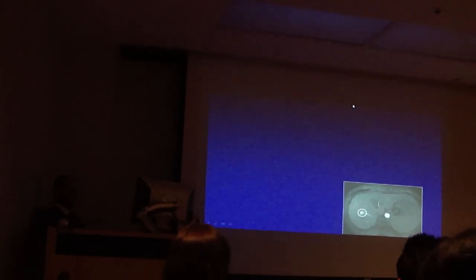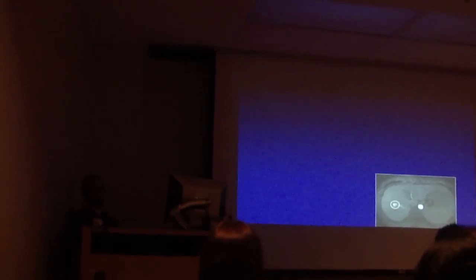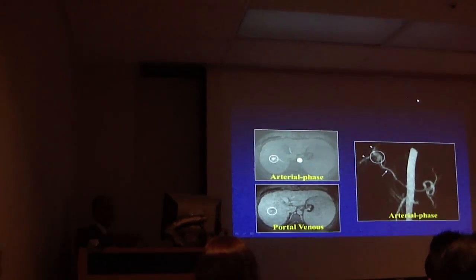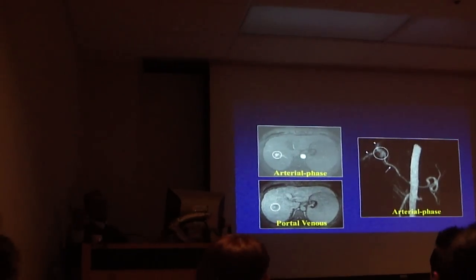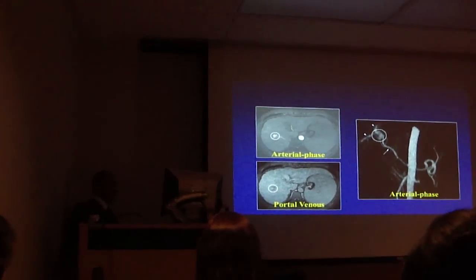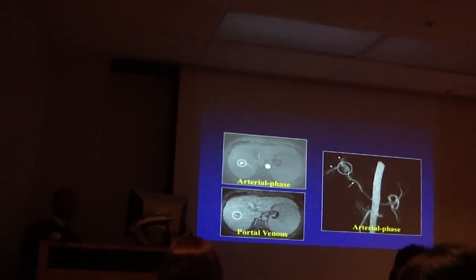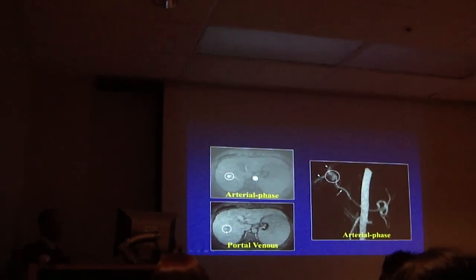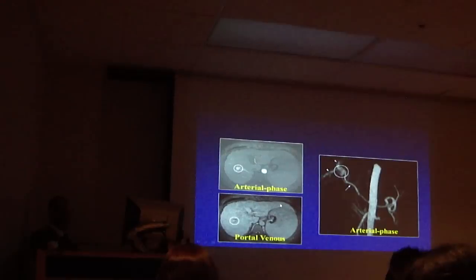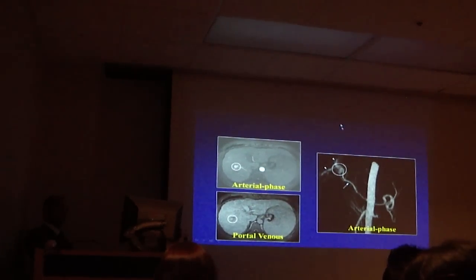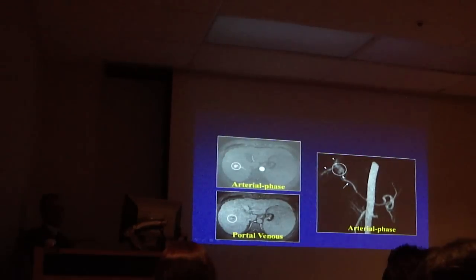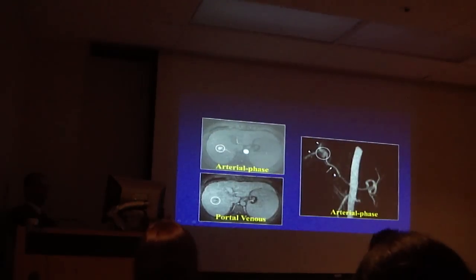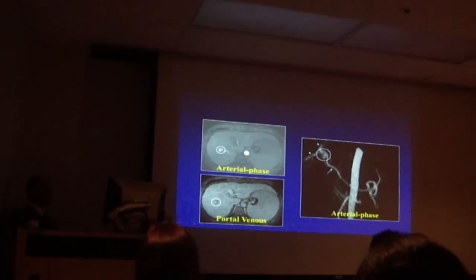Next lesion — bad or good? It's ill-circumscribed. Does it wash out? No. The liver is cirrhotic. A branch of the hepatic artery and portal vein filling — this is an arteriovenous fistula. The previous one was a veno-venous fistula. This is an arteriovenous fistula. They are all hyper-enhancing but none of them demonstrate washout. What are the two things to remember after this lecture? Margin and washout.